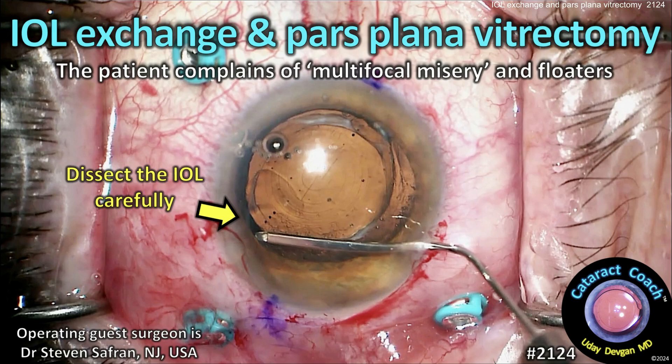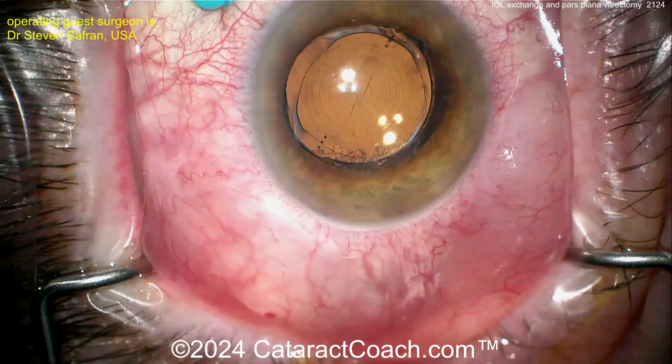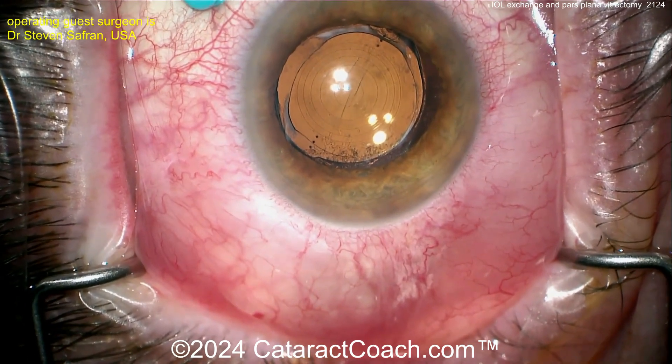CataractCoach.com. IOL Exchange and Pars Plana Vitrectomy. The patient complains of multifocal misery and floaters. Fun case here from the master, Dr. Steve Safran.